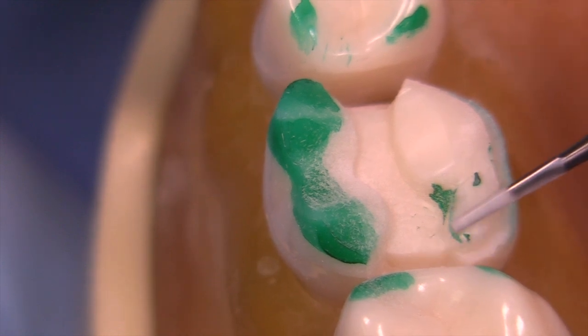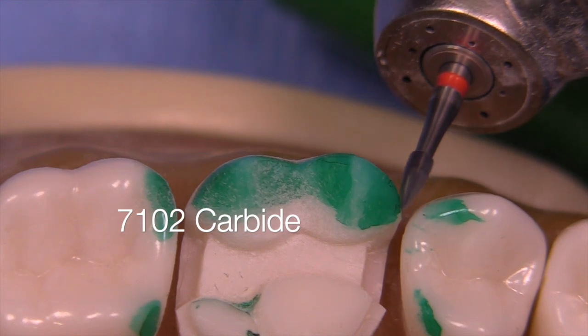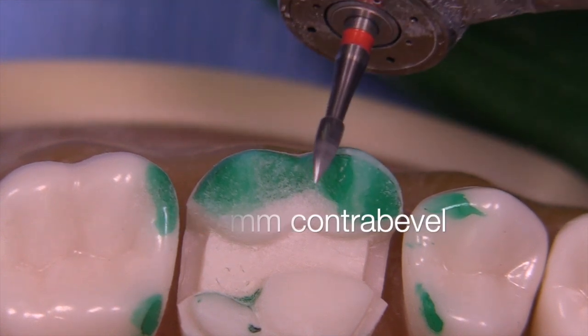Don't forget there's going to be a drop between the mesial lingual and distal lingual cusp of approximately one millimeter. The 7102 carbide has a small tip and is great for creating a 0.2 to 0.3 millimeter contrabevel.